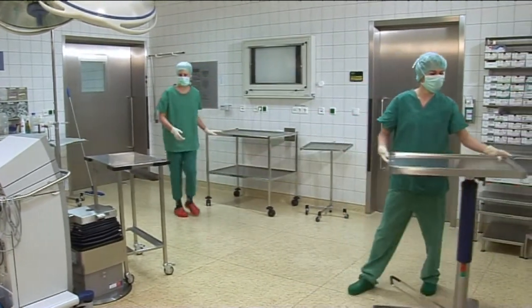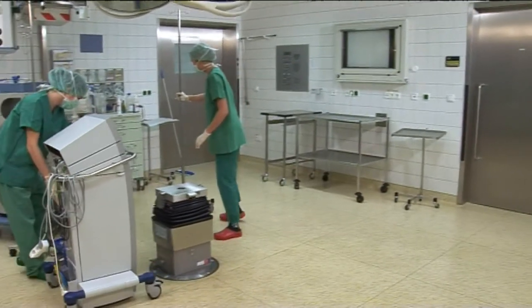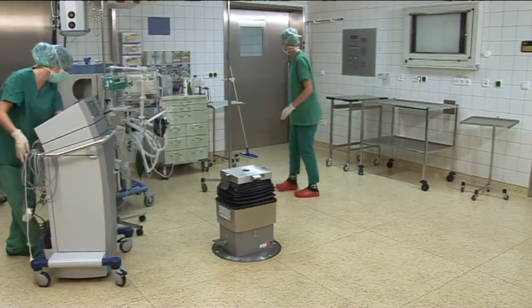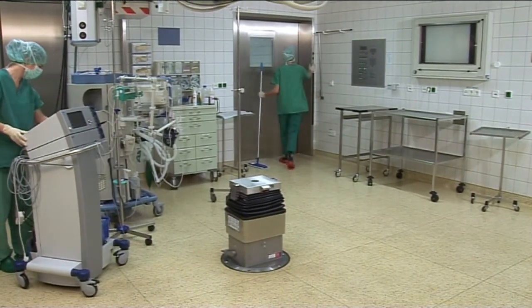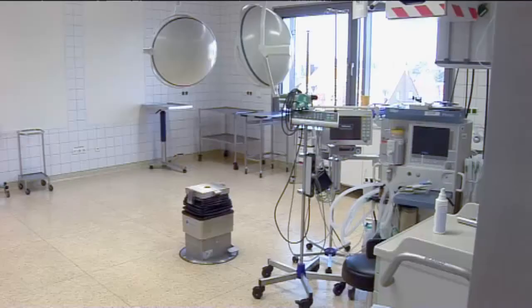After an appropriate waiting period, all mobile objects can be moved back to their place and the remaining surface is wiped according to the described procedure. Completion. The operating theatre is ready for the next patients or for the next day.